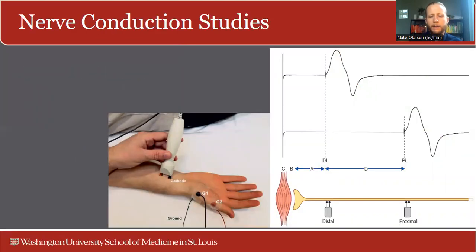So let's dive a little bit more into the specifics. We're not going to get too concrete. You're going to get a lot of time to practice in the future workshop. But so we have some shared understanding about what nerve conduction studies are. They're really the shocks. That's what patients will call them. And really, that's just an imparting of an electrical impulse through a nerve, and then we are picking up the communication of that electrical impulse with our electrodes.